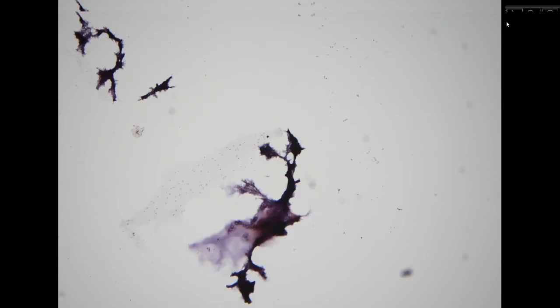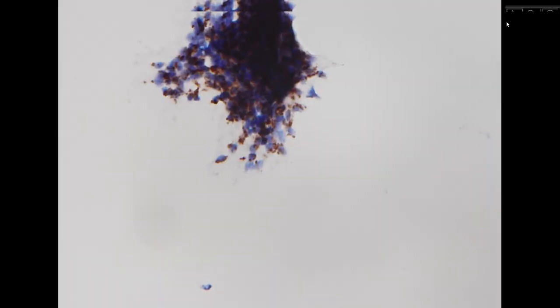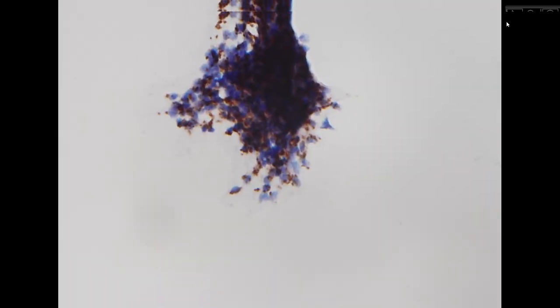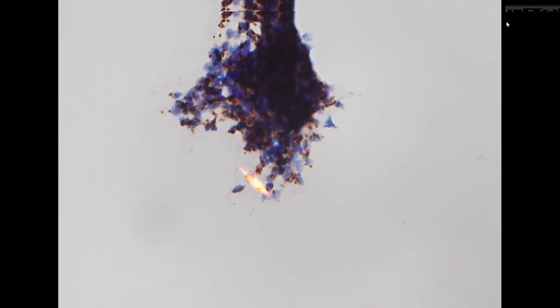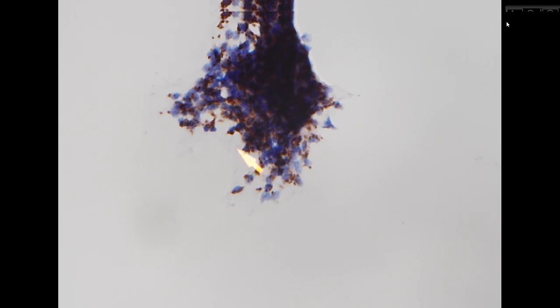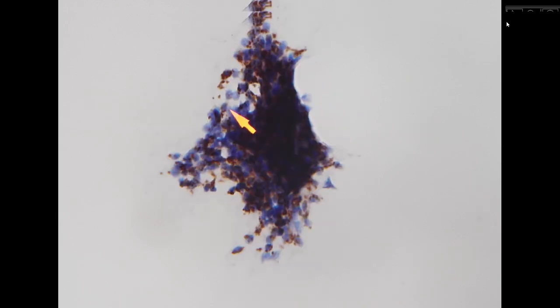Additionally, we also performed parathyroid hormone, which is a protein product. It's a secretory protein product, so it should be a cytoplasmic staining. In each of these cells, you can appreciate in the cytoplasm a clear dot-like distribution in almost every cell. So this suggests that these cells produce parathyroid hormone in the cytoplasm. So the stain is also positive.